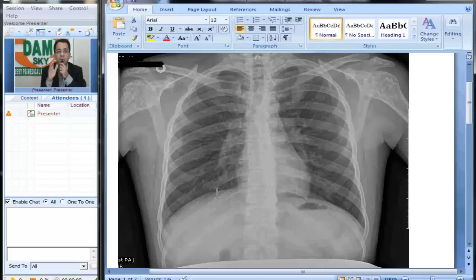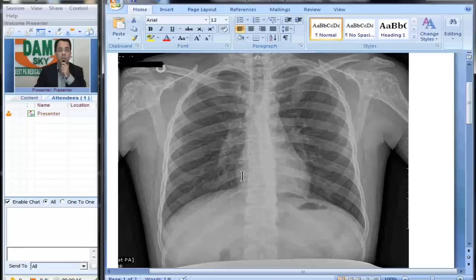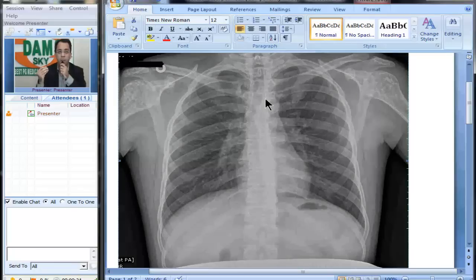This is a chest x-ray presented to you as part of routine health checkup. Do you see any abnormality in this chest x-ray? As a resident, you would always want to report the chest x-ray using your own method, going step by step. Let us look at the trachea — trachea looks central, little bit on the right but looks normal.